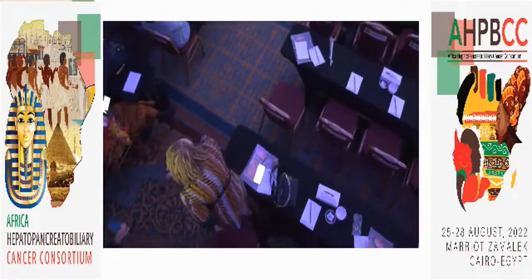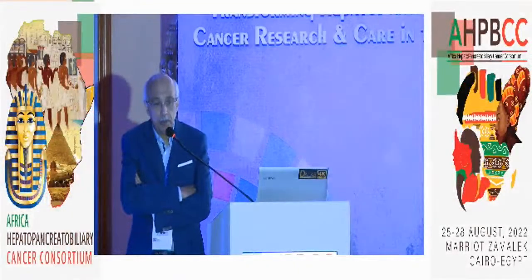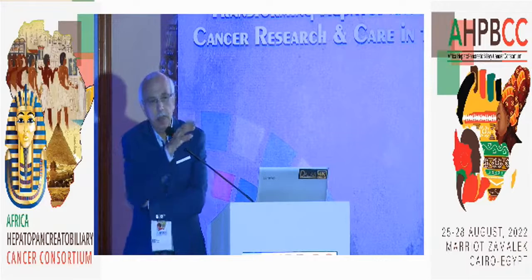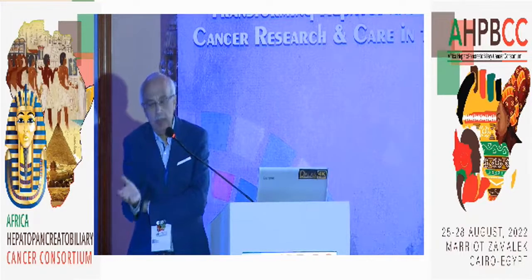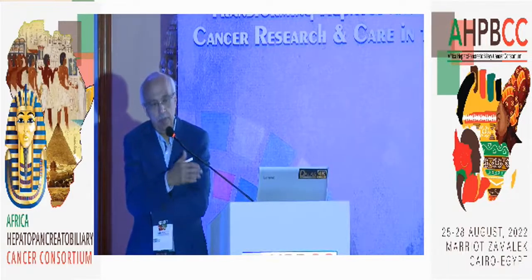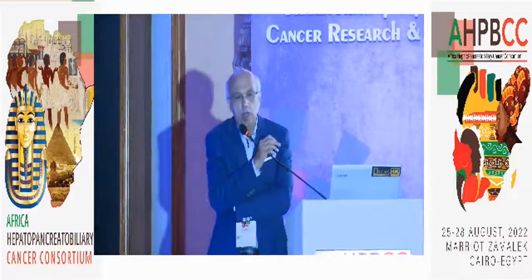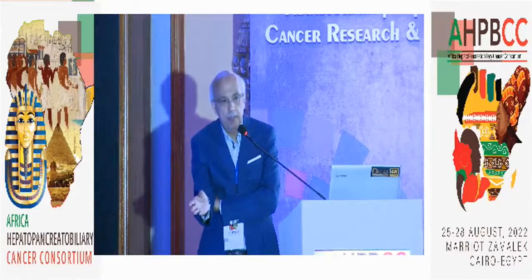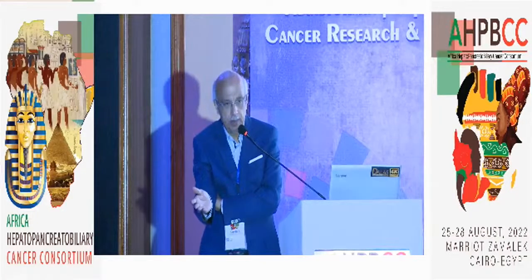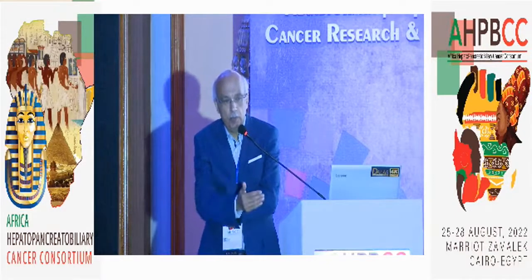The shear wave velocity is to evaluate the degree of fibrosis, cirrhosis. It is not implemented to detect focal lesions or tumors of the liver. We use this shear wave with different machines to get the F score of the patients. For example, if you would like to know the real liver status of these patients, is it just a normal liver or does it have a degree of liver cirrhosis?